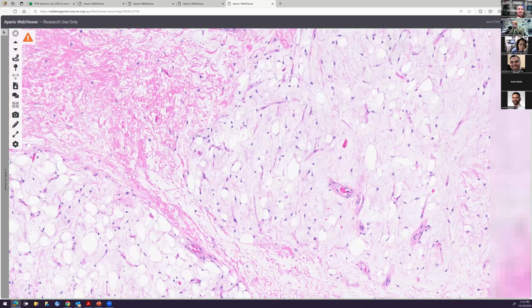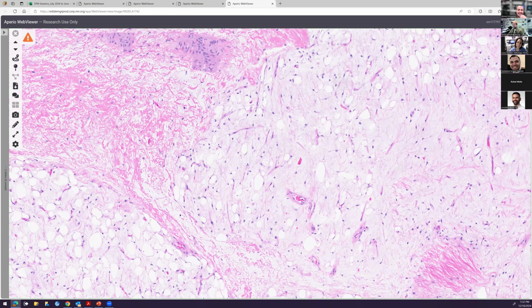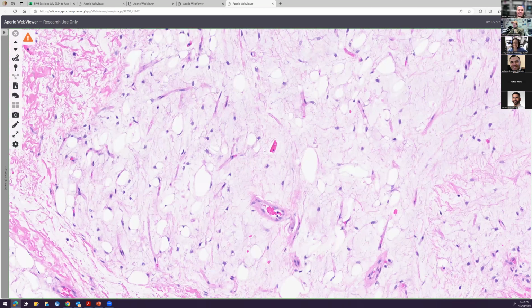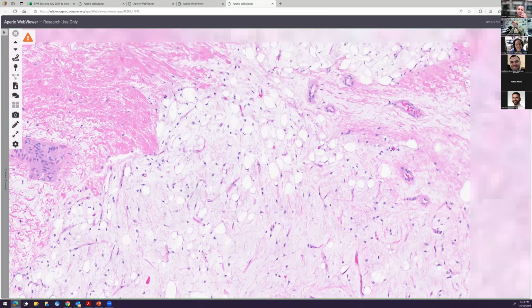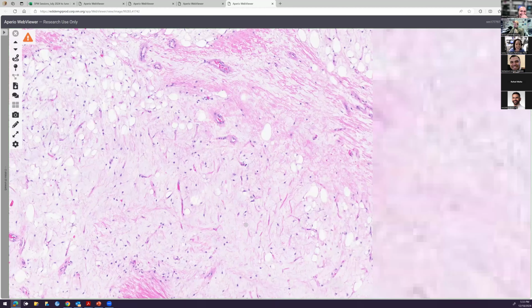So Alcino was right on. Wait, Mark, this one kind of looks myxoid, this one looks like liposarcoma, so different from the other one. It doesn't even have that blue look to it. Oh, come on now. It looks like myxoid, right? Now you're wondering, could this be myxoid liposarcoma? No, I mean, it has univacuolated lipoblasts, a lot of lipoblasts. That's true. It has characteristic vasculature. That's true.